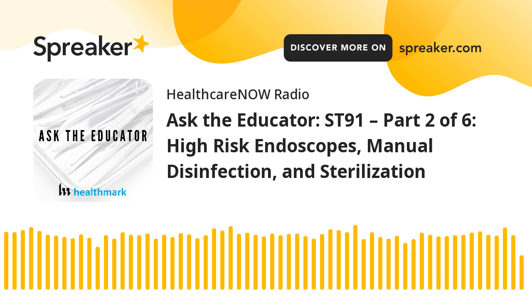No, that's good. Actually, I like that you brought up the part about the facility having some flexibility in determining what else could be considered a high risk endoscope in their facility. I can't help but remember one physician at one of our health system locations, back when I was working in the hospital, who was using a common flexible endoscope for different kinds of procedures that no one else was really doing. And there was a high incidence of damage to the scope based on a newer, different procedure that he was doing that no one else was doing with the scope.